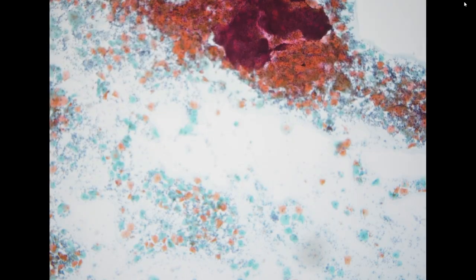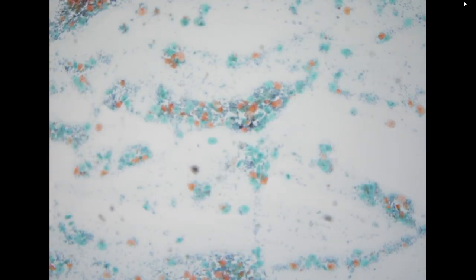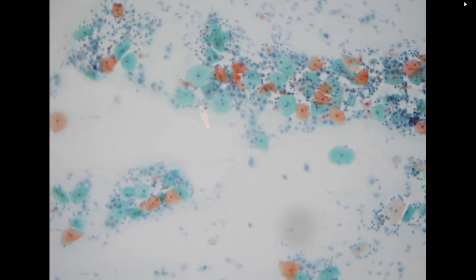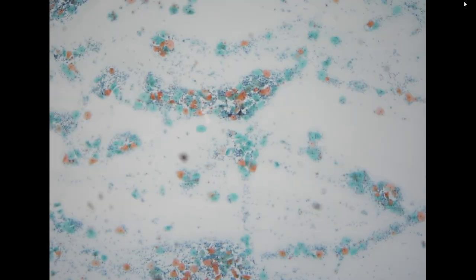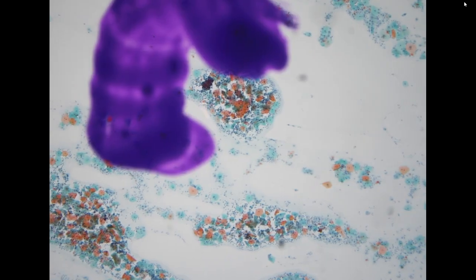So finally, there's a pap smear. The patient is a 39-year-old female. This is her first pap smear in our hospital. We can appreciate that we do have a lot of superficial cells, some intermediate cells, so the patient seems to be young. And the specimen, I would have to say, is not very easy for interpretation.